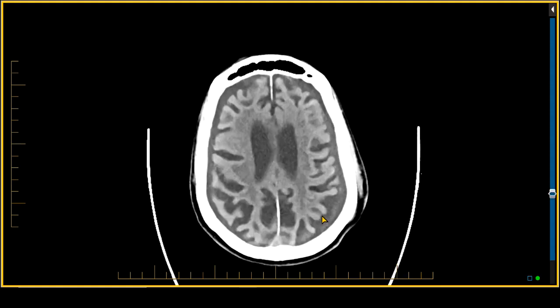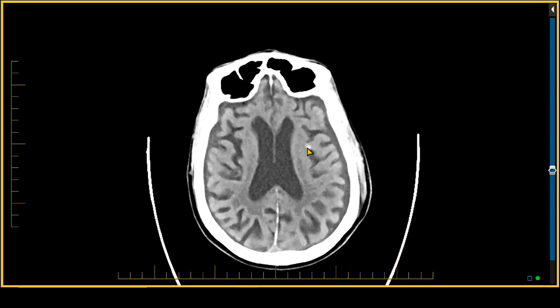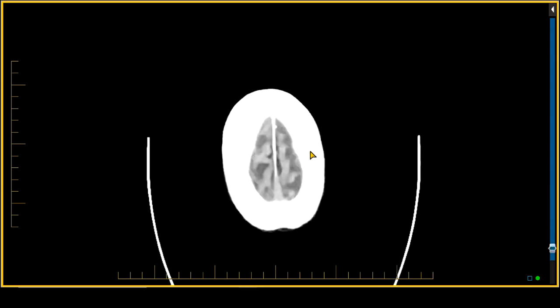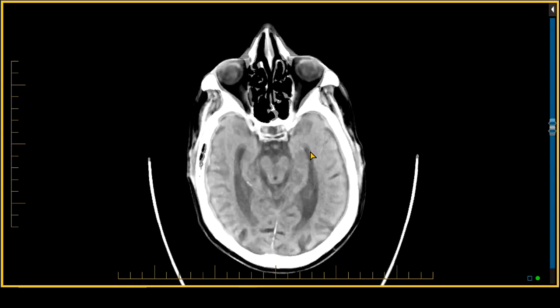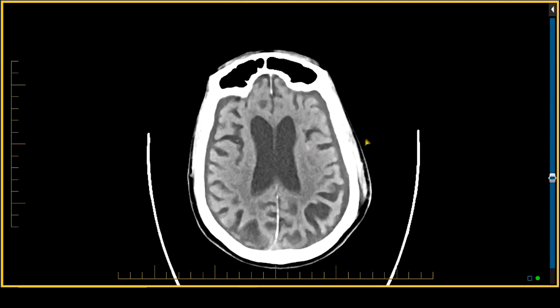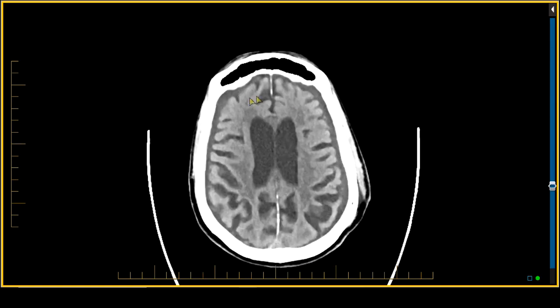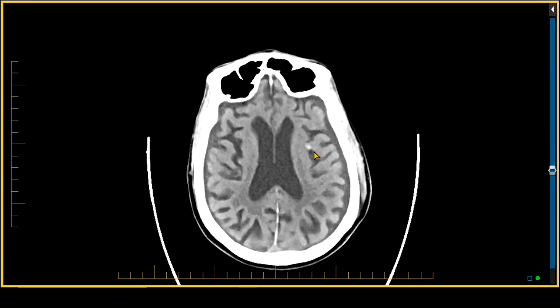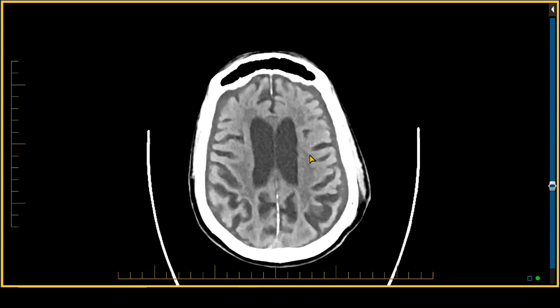There was a single section in which there appeared to be a small area of hemorrhage associated with the sylvian fissure on the left side. But this would have been read as bilateral chronic subdural hematomas in a patient demonstrating marked volume loss and a small focus of blood products in the subarachnoid space around the left sylvian fissure.